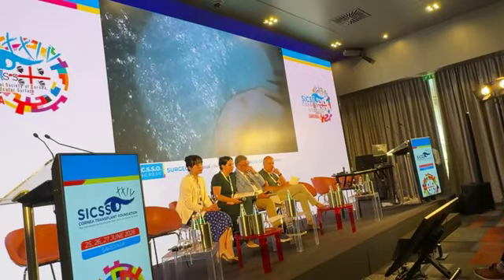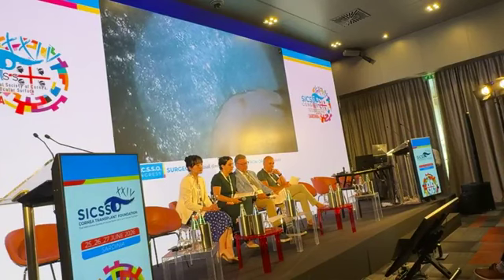He uses an S mark. Already, the S mark is done, I think. Okay, now we are checking because we might be fine with the pre-done mark. Now we'll see if he prefers to do that himself or if it's already well visible on the cornea. We have an F mark. I think that now you can see the tissue. No, F is there, not S. Correct. There is an F mark. So the F mark is there. Give me a friend.